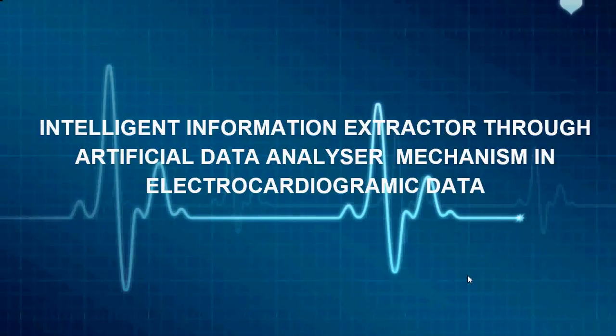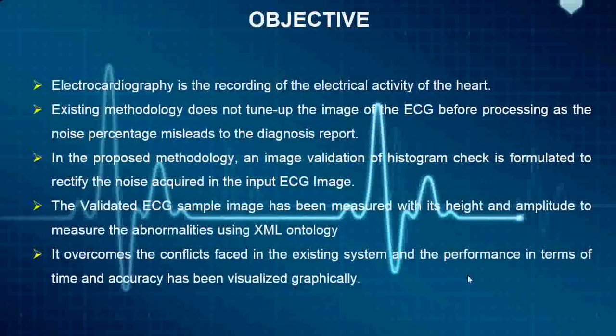Project title is Intelligent Information Extractor through Artificial Data Analyzer Mechanism in Electrocardiogramic Data. Objective: ECG, electrocardiography, is the recording of the electrical activity of the heart. It should have a systematic approach to interpreting the ECG. You should be able to identify ECG abnormalities.